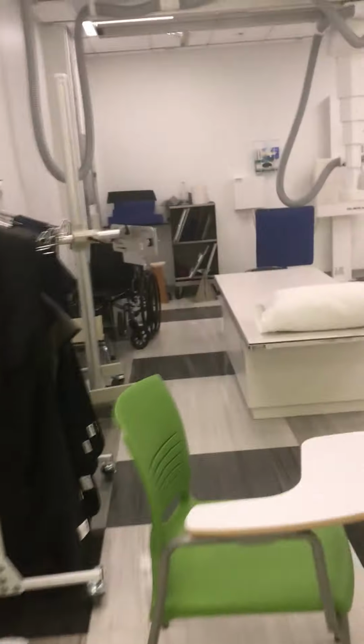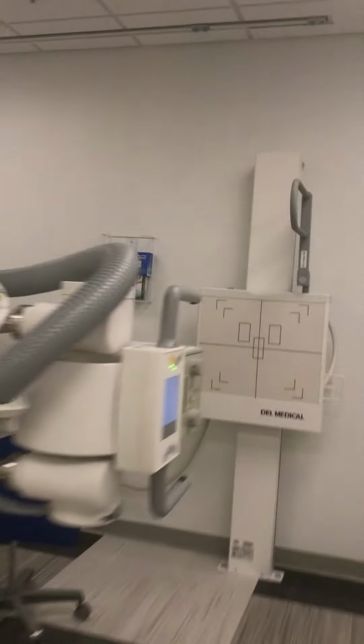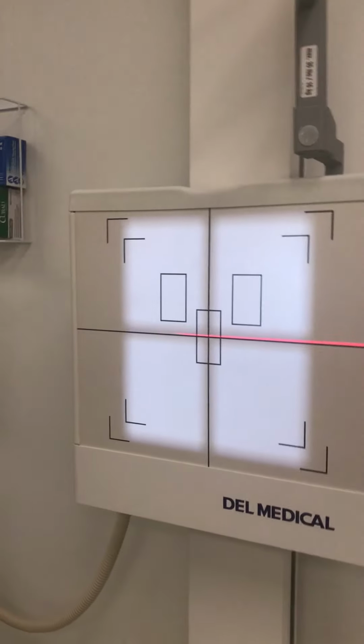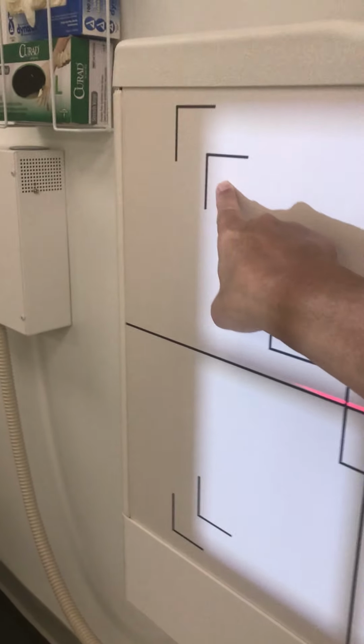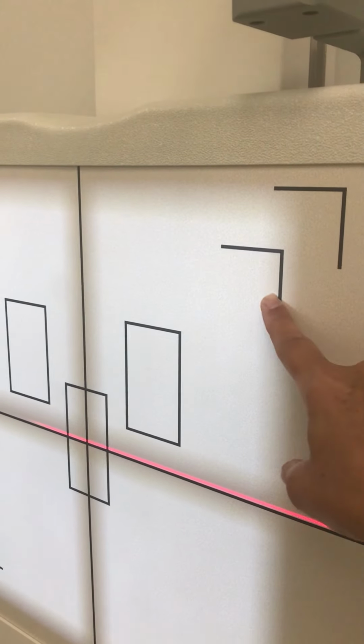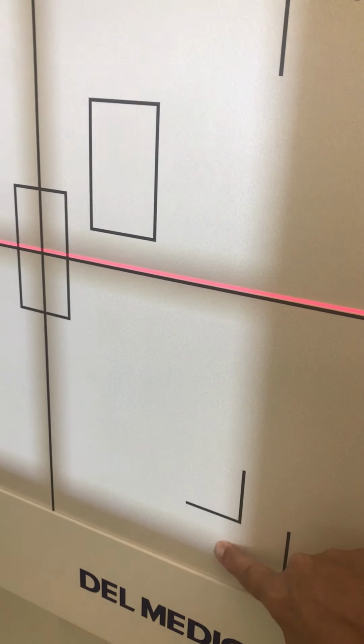Our collimation size automatically adjusts to that correct 14 by 17 inch size. 14 across, 14 across, and 17 inches lengthwise.